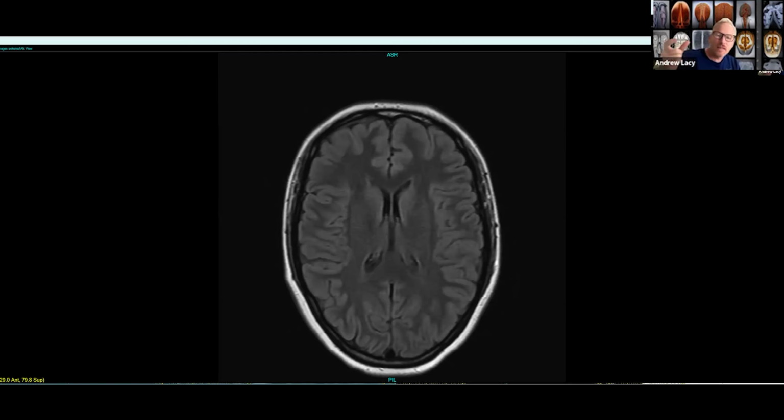So, let's see what other questions we have that are unanswered. Talk a little bit about maybe alternating scans. We talked about the difference between comprehensive and head and torso cancer scan. What are your thoughts about doing a comprehensive one this month, but then following that up with one of the other scans at a yearly interval, sort of alternating between these? I think, and this is my opinion, the whole body comprehensive exam is a great one to establish as your first exam to get a baseline of the entire body. And then based on medical history and clinical context, and also what we're finding on these exams, you can either follow up with another comprehensive one, or you could even reduce it to the head and torso, or torso. Let's say you don't want to image your spine anymore, and you're like, hey, I'm not worried about it, my spine's great, I don't really need to track it next year. You can do the head and torso or the torso exam and do more of an abbreviated version.